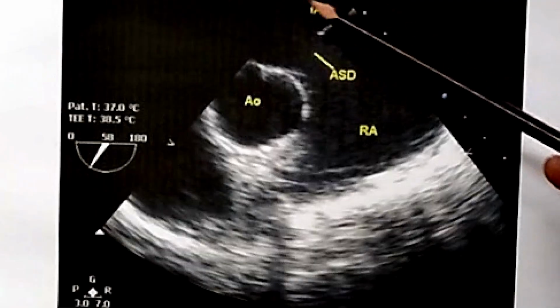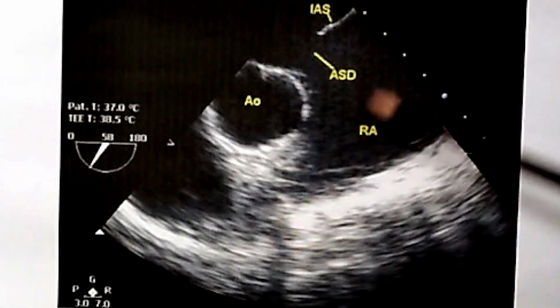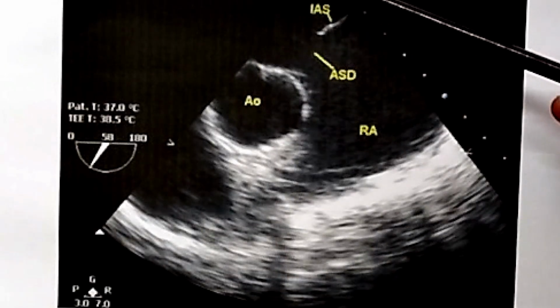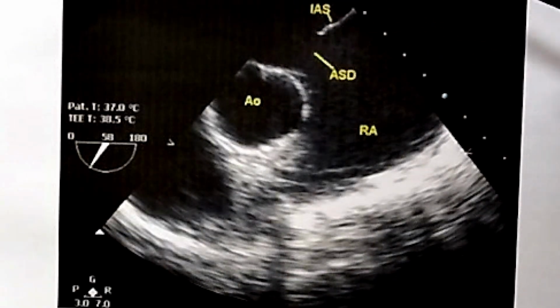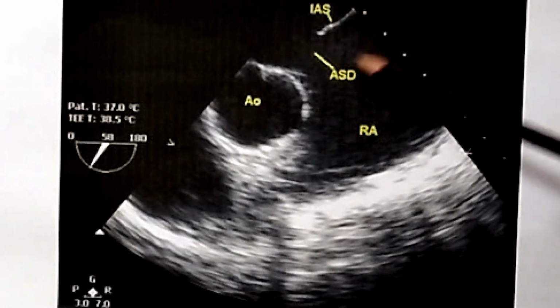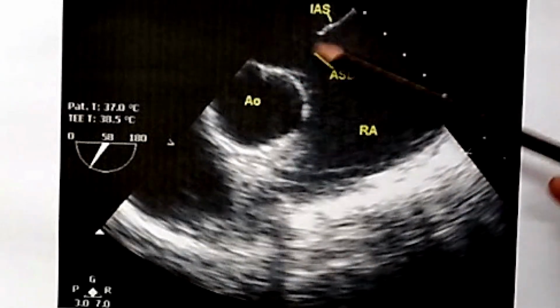And the probe will be here. This is the aorta cross section. This is the interatrial septum, because the probe is in the esophagus just near the left atrium. This is the right atrium. This is part of the interatrial septum and the aorta. And this is the atrial septal defect.